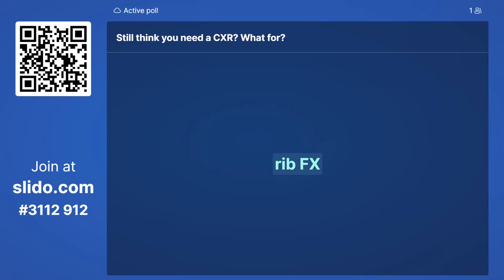Aeration of lung fields. So no, Roberto, you don't need a chest x-ray to see your aeration, because are you going to do a 24 lung point exam on every patient? You're probably not, but you don't need a chest x-ray, because you're asking a very specific clinical question. Like, which part of my lung is aerated? Is it nice to have one snapshot and you get a chest x-ray and it looks totally normal? Do I need to sit there? You probably don't. But then you could have listened to the chest and they're not even here for a respiratory complaint. Chest x-rays are not evil.